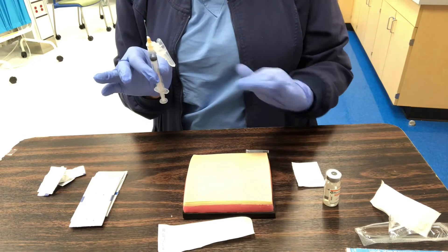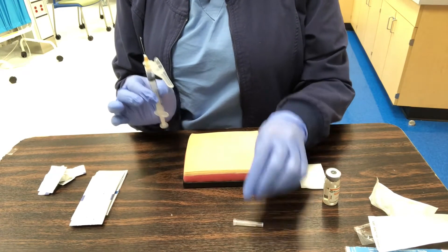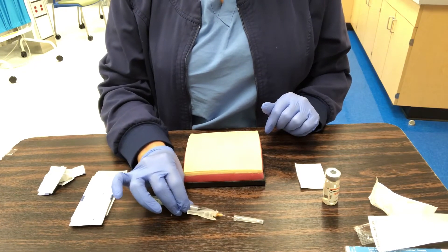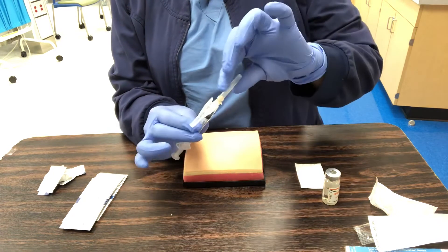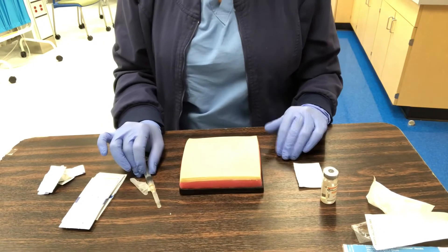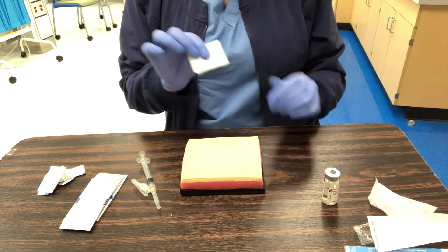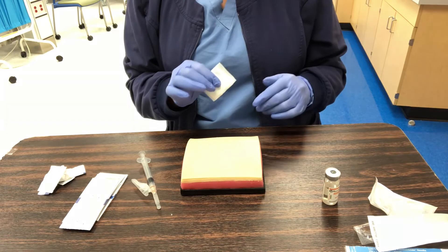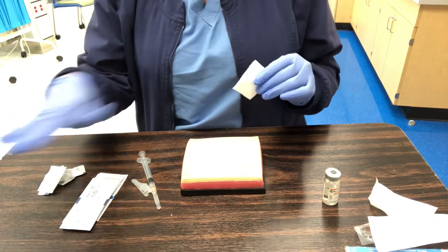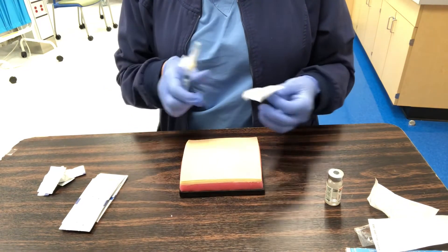I'm right at bedside but not ready to inject yet. I'll use the scoop method to recap my clean needle — scoop into the cap, lift up, and snap it back on — then set it on my tray. I've already talked to the patient and done all checks. I have my gauze ready. If you'd like a band-aid open and ready, don't place it on the bedside table, as those surfaces are considered contaminated.